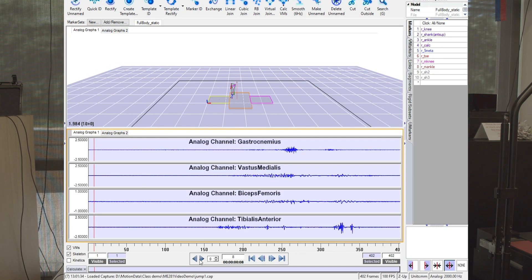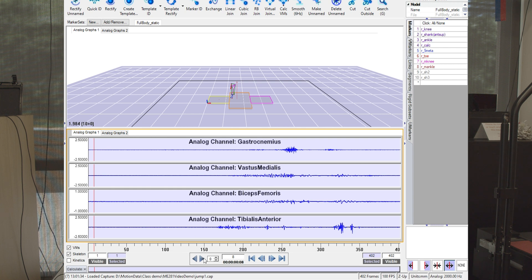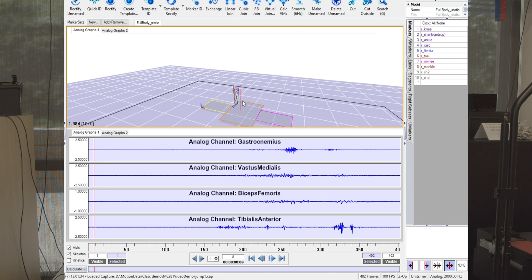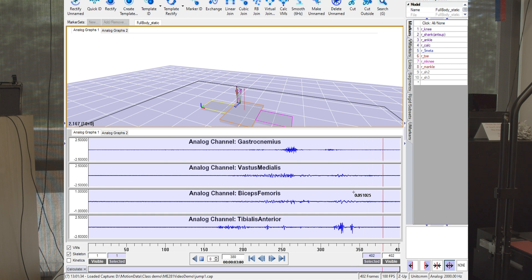So let's have a look at what happened with the EMG on Hannah's different muscles. Scott's going to play the video. As you can see, as I go through the crouch here and then the liftoff phase, we see different muscle activation patterns.